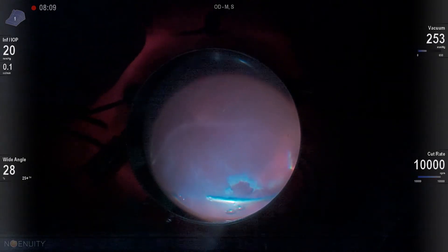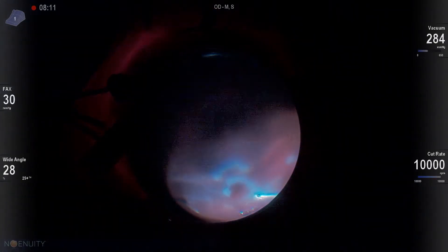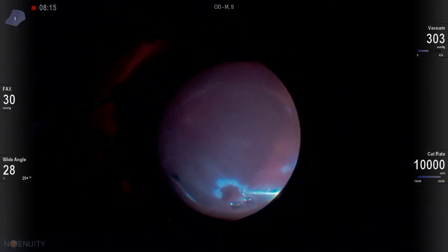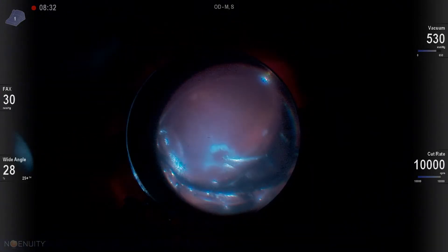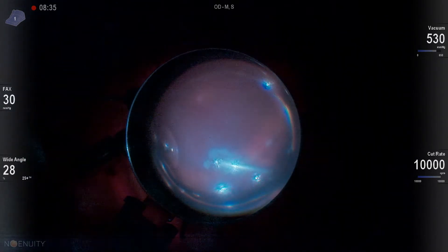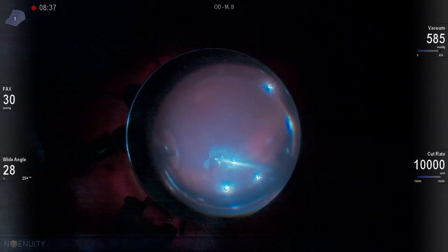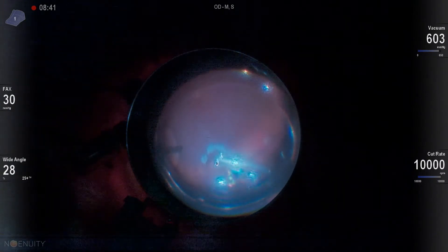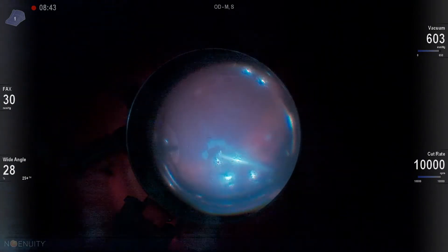The cataract surgeon did a great job. Surprisingly, the retina was not that stiff. We put a huge buckle on her — a 40-50 tunneled all the way around. And inferiorly, we put two 106 elements under that 40-50. So she has a giant buckle, and that led us to be able to get her attached.